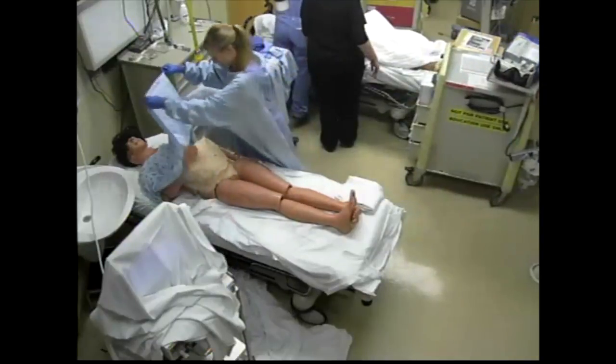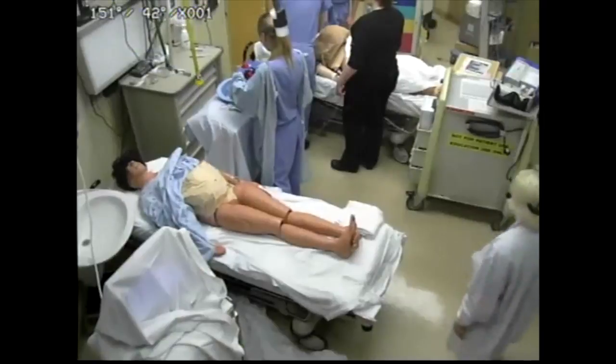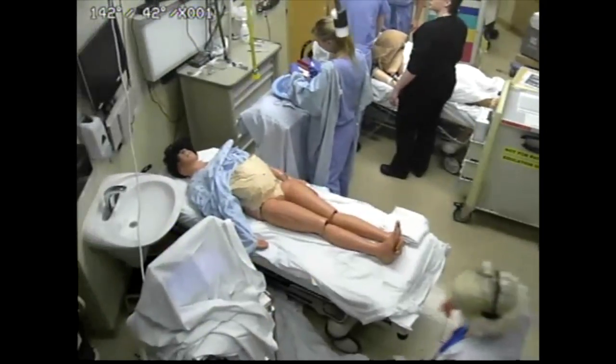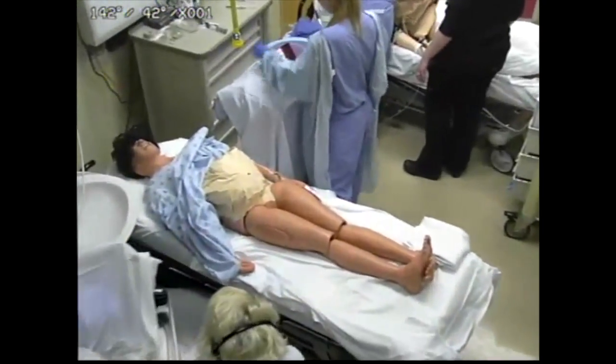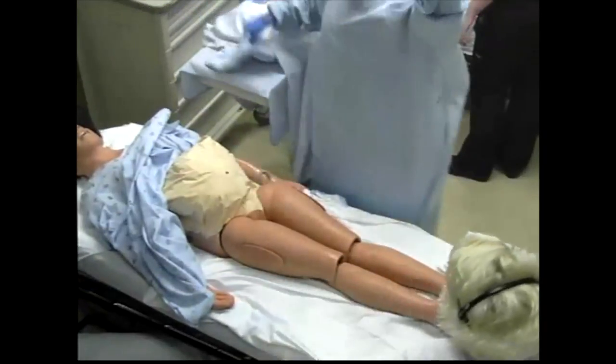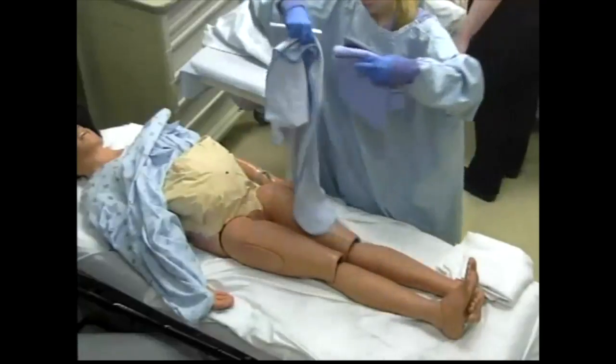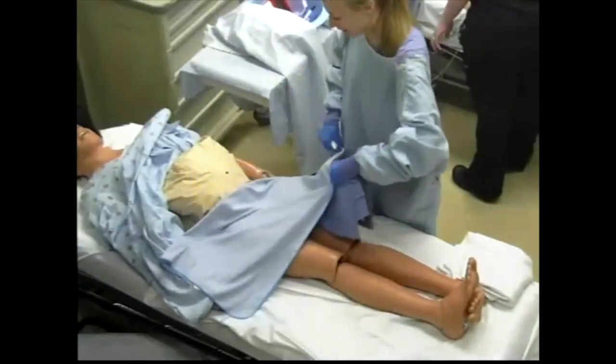I purposely shut this off. Go with that monitor. There's about 45 seconds in, so I'll switch out at two minutes. We're doing epinephrine right now — I'll try to keep her alive to perfuse the baby. Elle is going to prepare for a perimortem C-section. Excellent. Shawna, do you have other ideas? Or Elle? No.